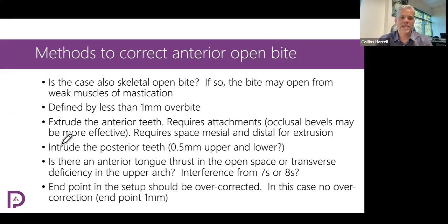Okay, so in some of those cases, we'll be really focusing on intruding the posterior teeth to get the bite to close rather than extruding the anterior teeth. But in a lot of cases, we'll be both intruding the posterior teeth and extruding the anterior teeth to close the open bite. And you'll see that demonstrated better later in some other slides.